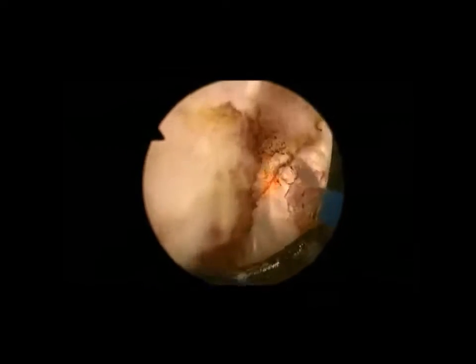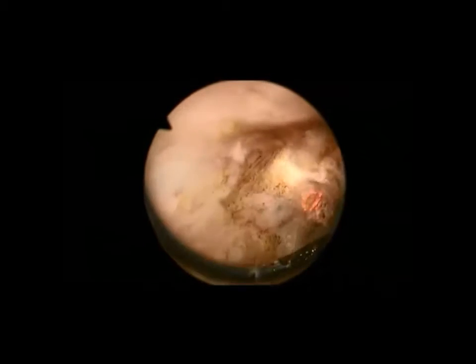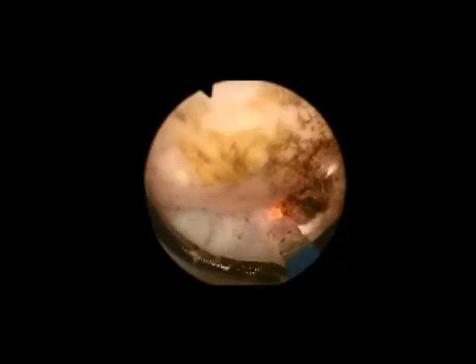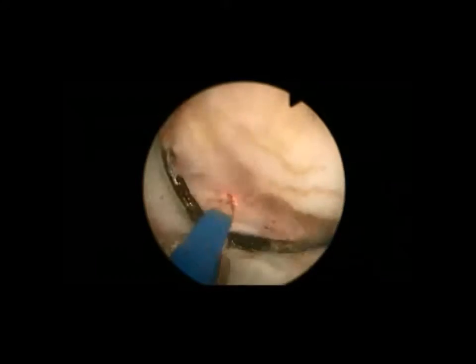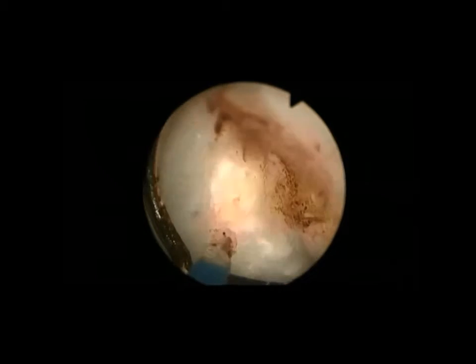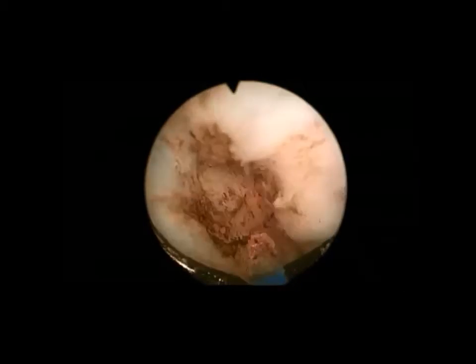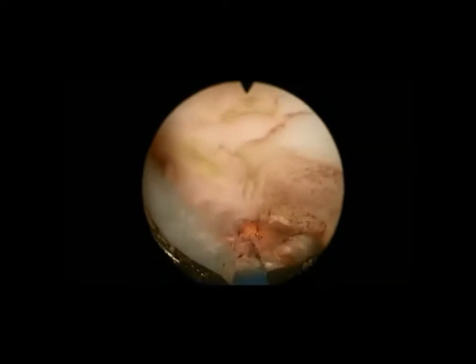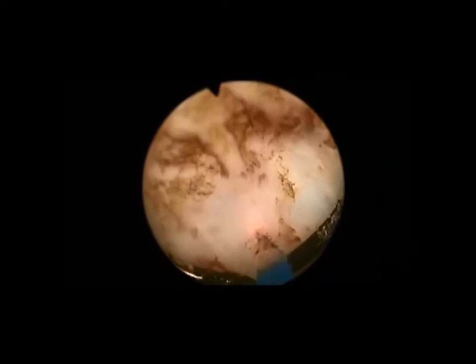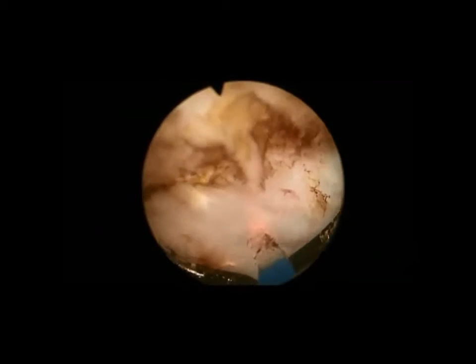Here we are completing that 7 o'clock incision while undermining the medial aspect of that right lateral lobe, working up the face or reflection of the bladder neck. A great deal of this dissection of the lateral lobe is done side to side. Direct retrograde enucleation is also performed. This is much easier to accomplish when the attachment underlying the adenoma has been narrowed bilaterally.